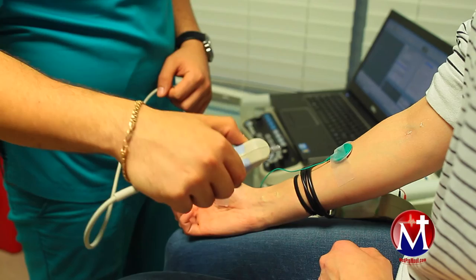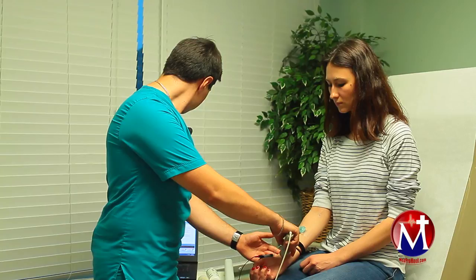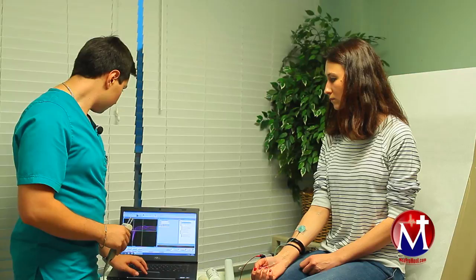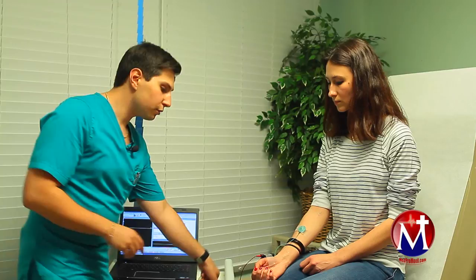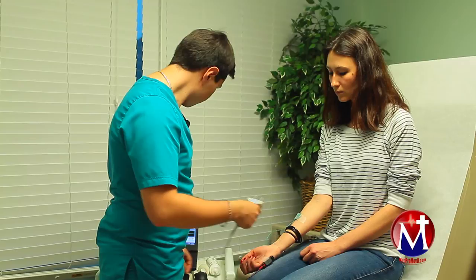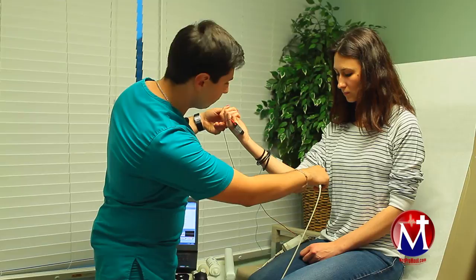The next step, we're going to record the median motor F waves. We made several stimulations, and we have a normal latency. Next, we have to replace the electrode on the other muscle to record the next nerve, which is ulnar motor. Going to stimulate the wrist. Next stimulation is below the elbow and above the elbow. We place the distance.